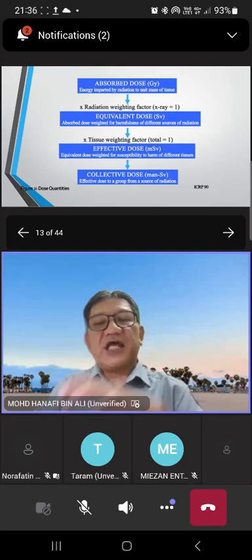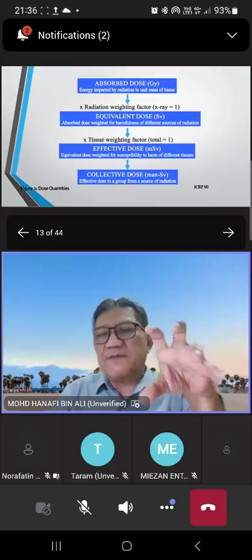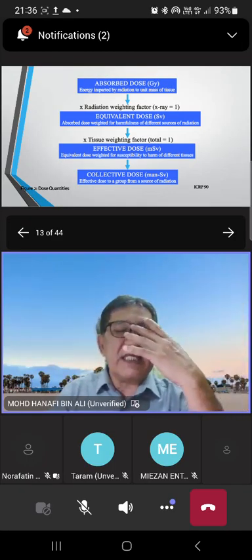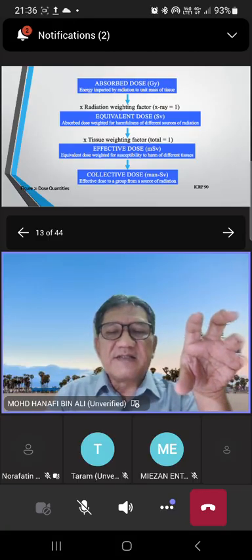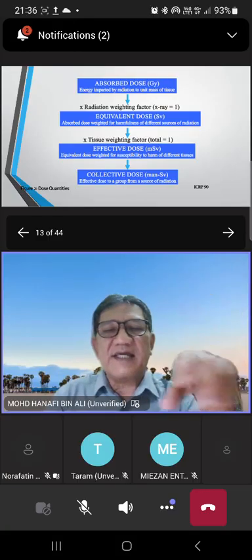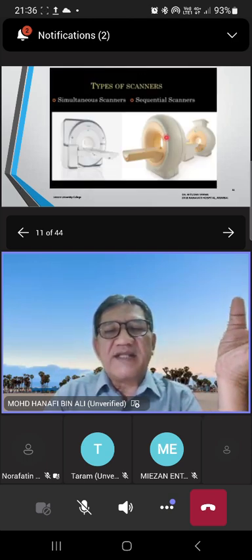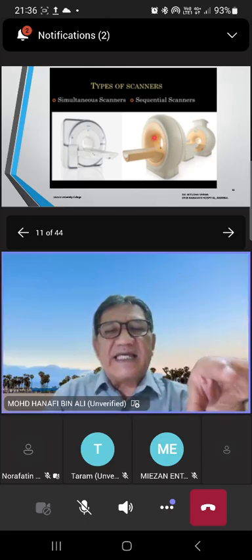I'll just skip that. So radiation dose, I think if you learned that in environments and something that uses units easily, I just simplify it in one slide here. Okay, radiation exposed, then we call it absorbed dose, unit gray. This is in air.